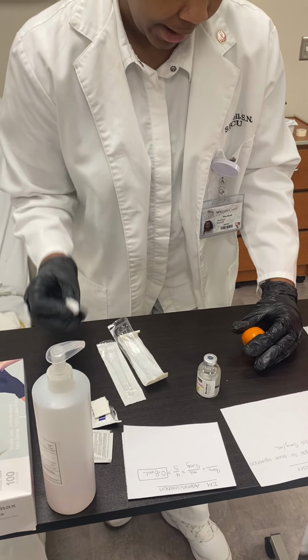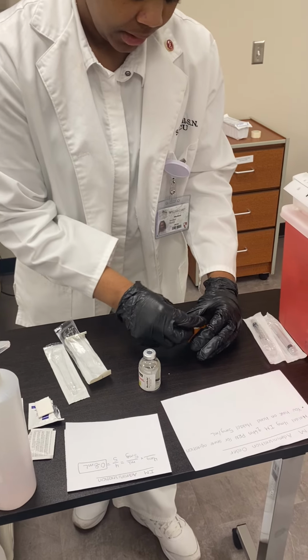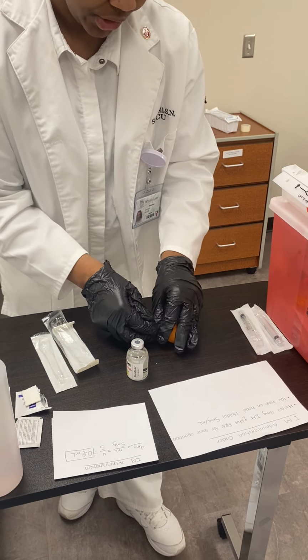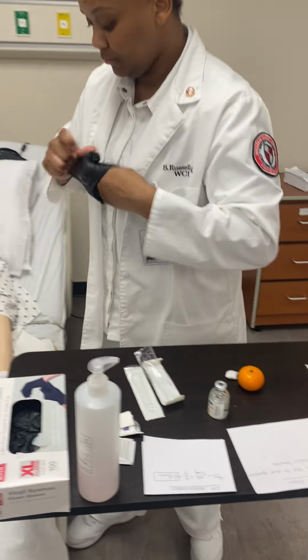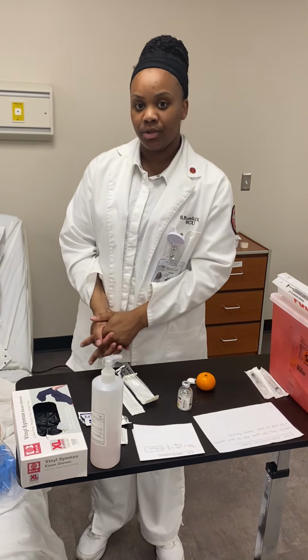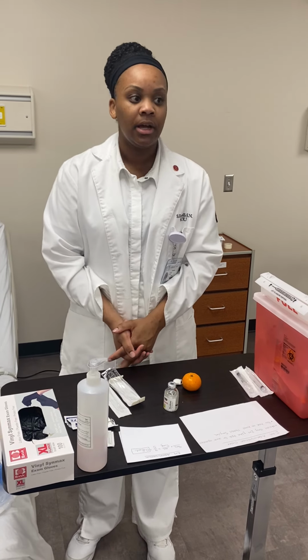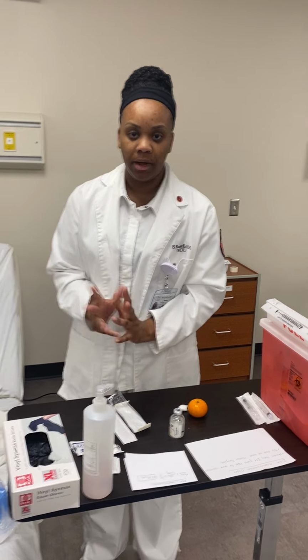Grab an alcohol prep pad, or preferably I'm going to use a cotton ball. Just hold tightly on that right deltoid injection site. And then I will go ahead and remove my gloves, wash my hands, and then I would document the procedure, the injection site, which I gave, which is the right deltoid, how the patient tolerated the medication, if there was any kind of redness or swelling on the patient's skin or around the injection site.